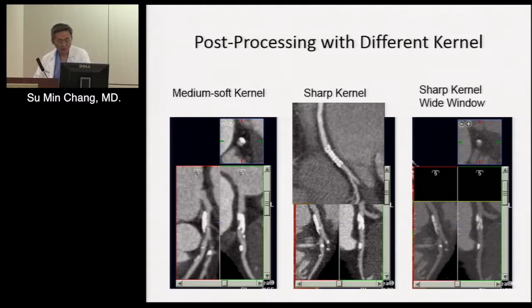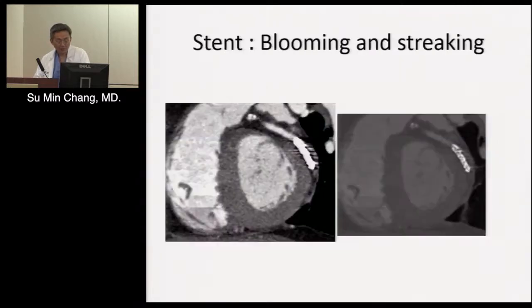You can see through a lumen, as in this example, on the left-hand side with the regular kernel. This is the type of filter you use. And then in the middle, you use a sharp kernel. On the right-hand side, you change the window setting. You can see that it allows you to assess the center of the vessel better than just the regular display. When you rotate with Dr. Mamarian, you'll hear him calling to the back there, Jeanette, give me the sharp kernel.